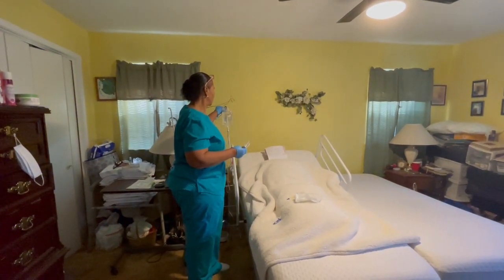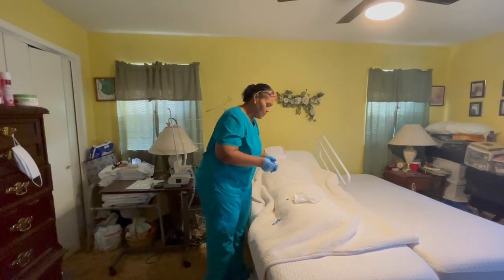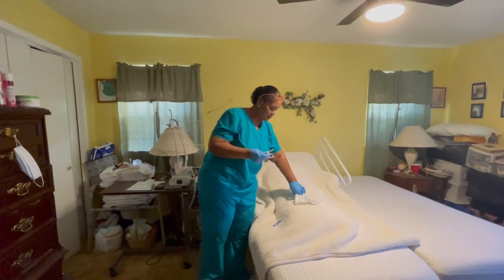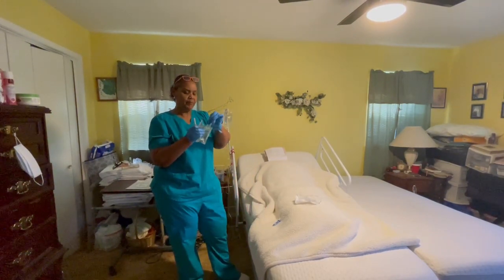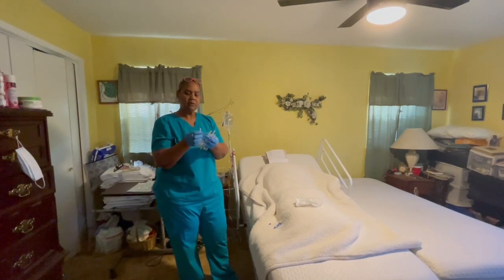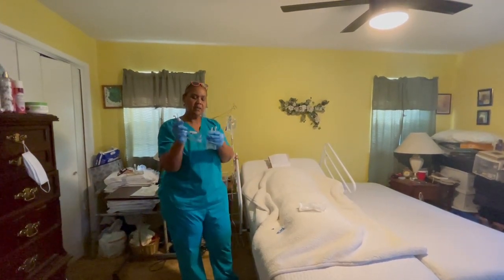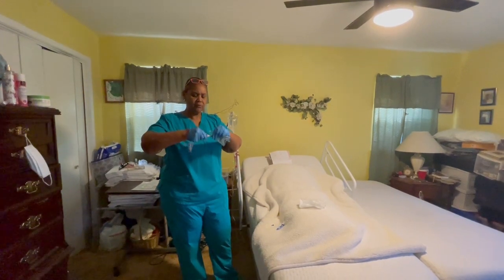And I'll just try to put that there. I don't want to tear up anything. Okay, so now I'm going to hook up my antibiotic and my secondary tubing. So I'm going to remove this blue part here. And then I'm going to remove this, making sure not to contaminate anything. I'm going to take the end, place it into my antibiotic with a twist and move.